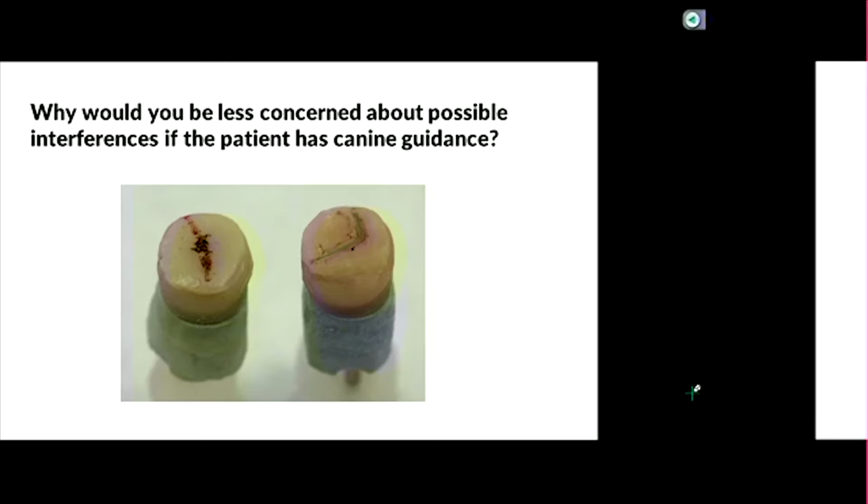So now on your articulator, when you move the jaw in the side-to-side motions, we have less separation in the posterior. So we're going to design our crown so that it'll clear the other teeth even when the inclination is at 0, okay, where there's less space in the back. Now, you take that same crown and you put it in the patient's mouth.